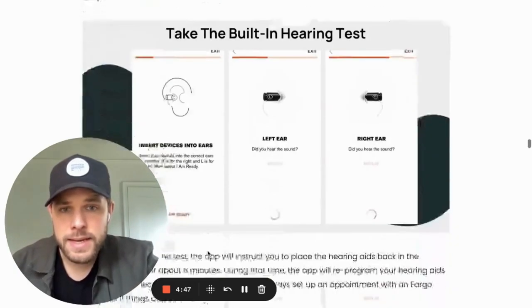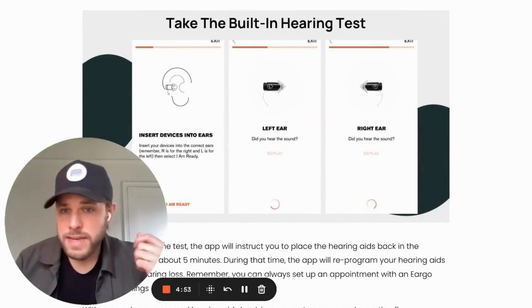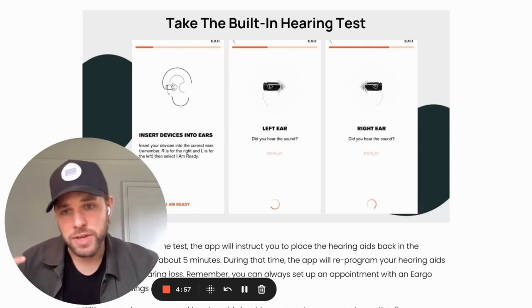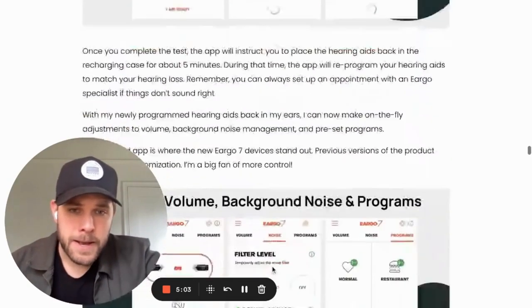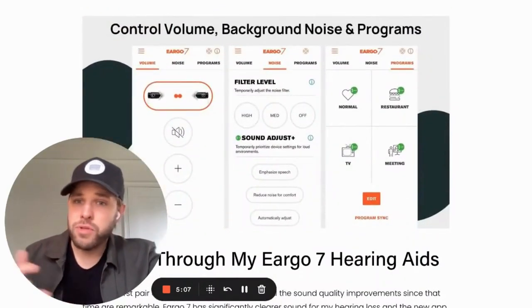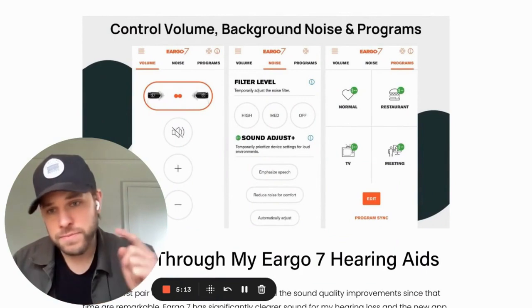Once I had my hearing aids in, the app prompted me to take a test. It's pretty simple — it plays a sound through one of the hearing aids, you say if you heard it or not, and it does the same on the other side. The results are then used to program your devices. Once you're done, you end up with three main screens to control your hearing aids. The first screen controls volume — simple up and down.